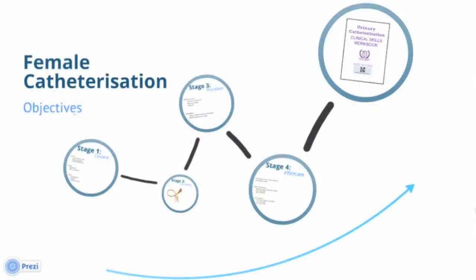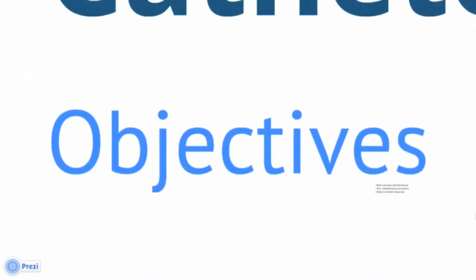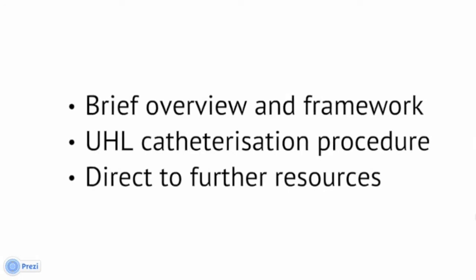Welcome to this clinical skills video. Today we are going to be focusing on catheterisation. The objectives of this video are to provide you with a brief overview and framework for performing the catheterisation procedure following the UHL guidelines. We will also direct you to further resources which contain more detailed information.